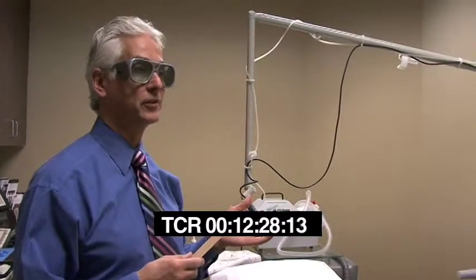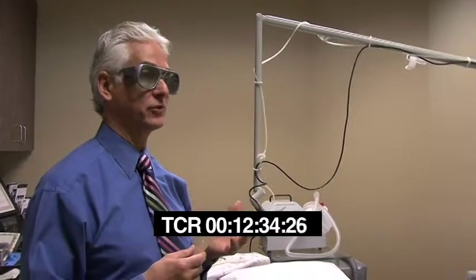With the previous CO2 laser, which was more of an ablative laser, basically treated the whole surface of the skin, and you didn't have skip areas. So the healing time was much more prolonged. It would take weeks for the patients to get their skin back to a normal color, whereas with this, they're healed within 3 to 5 days, and the pinkness is gone within 2 weeks. So that's one of the advantages of having the fractional CO2. Besides, it also allows us to penetrate deeper, so we can achieve a better result.